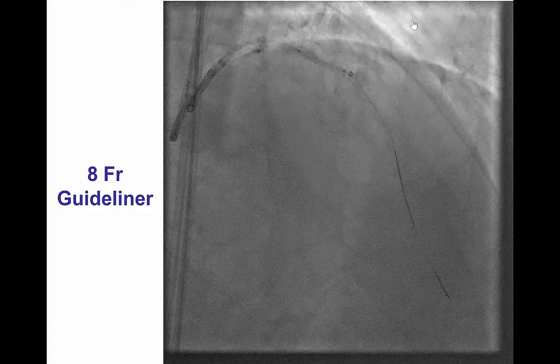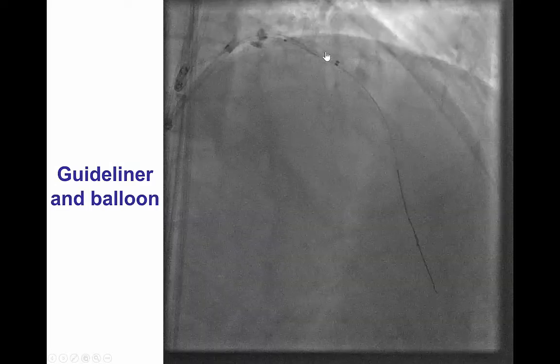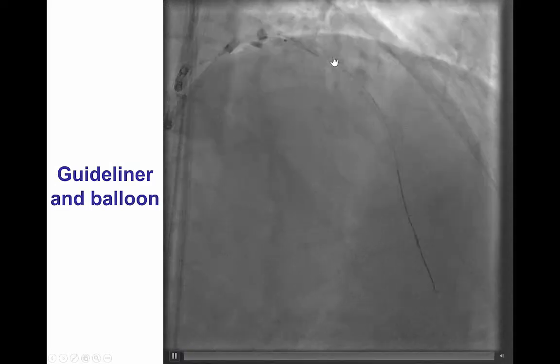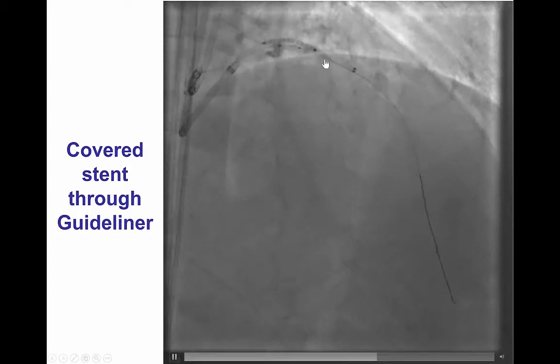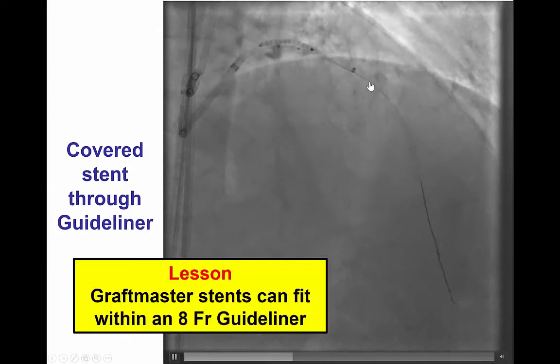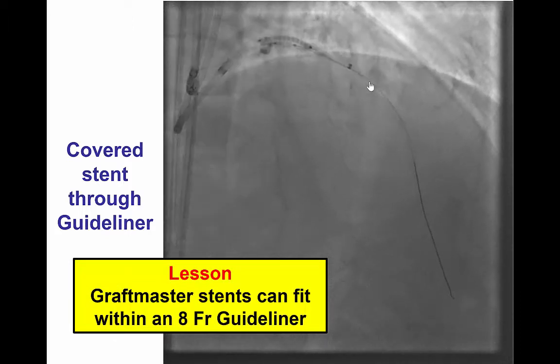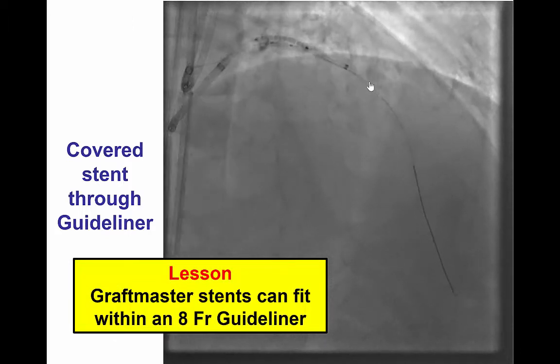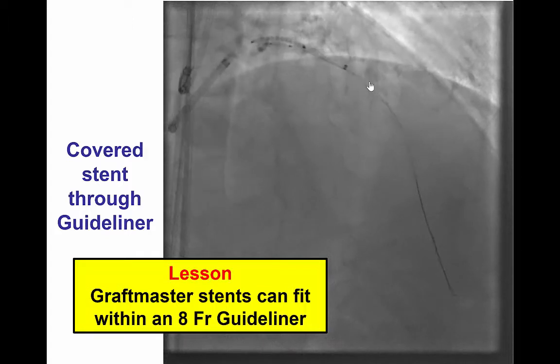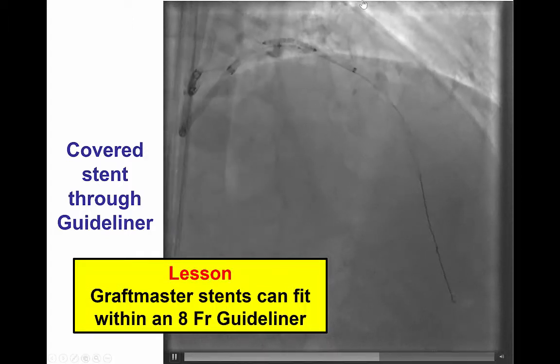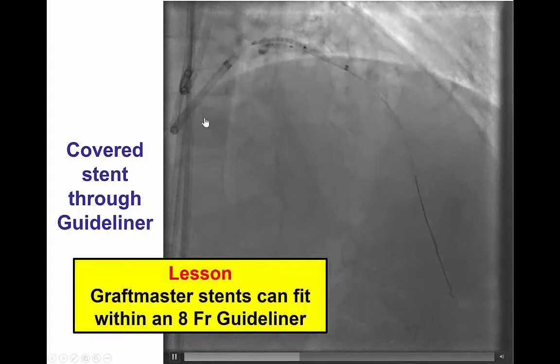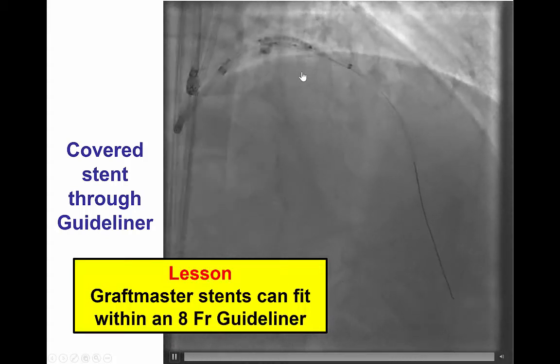We therefore used a GuideLiner — an 8-French GuideLiner delivered to the mid-LAD — and then we were able to deliver the covered stent through the GuideLiner all the way into the area of perforation. A covered stent can fit through a GuideLiner, and this may be best done by preloading the covered stent into the GuideLiner so there are no issues when the GuideLiner collar interacts with the stent trying to enter the GuideLiner cone.